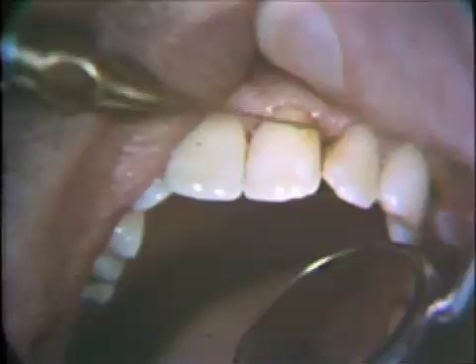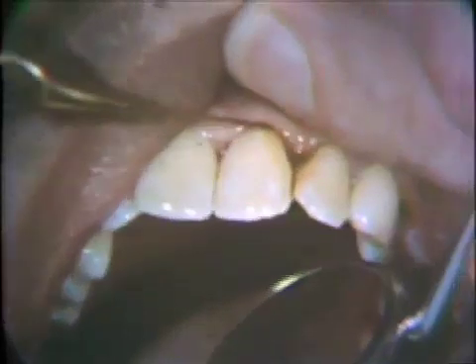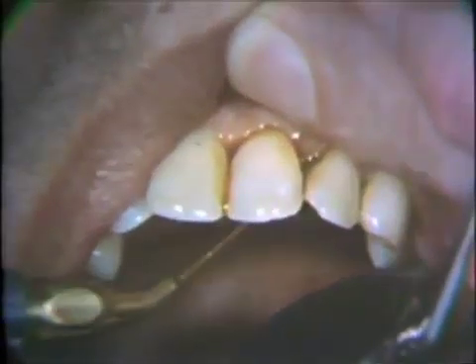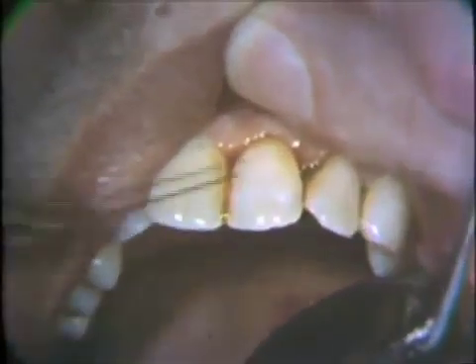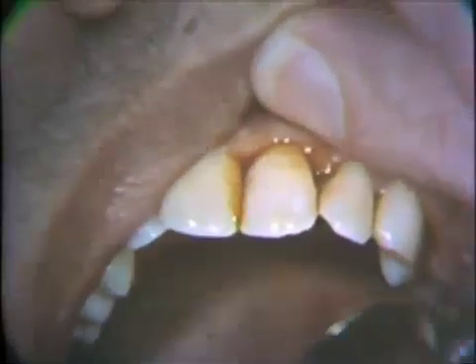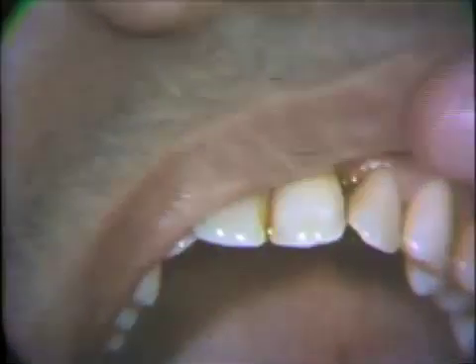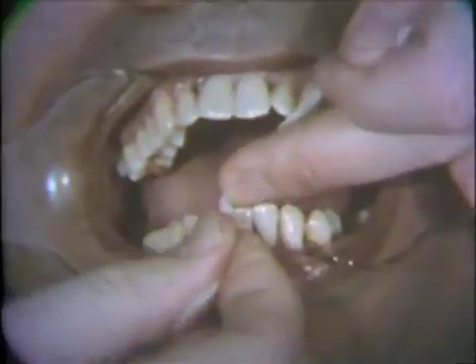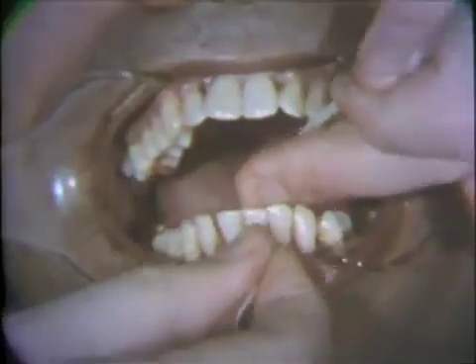Iodine lotion is again applied to the field of operation. The remaining teeth are also scaled and planed in a similar manner. When sufficient access is available, narrow, medium, or fine linen strips may be used to further smooth the interproximal surfaces.